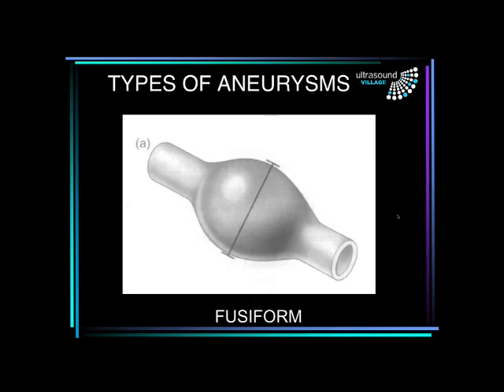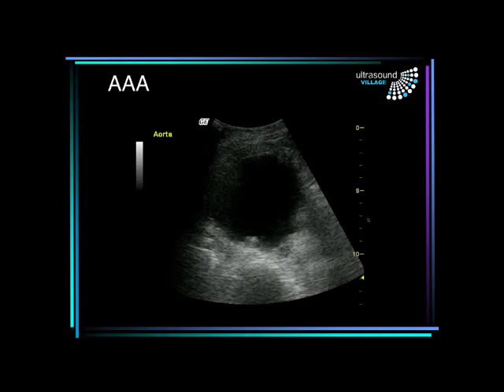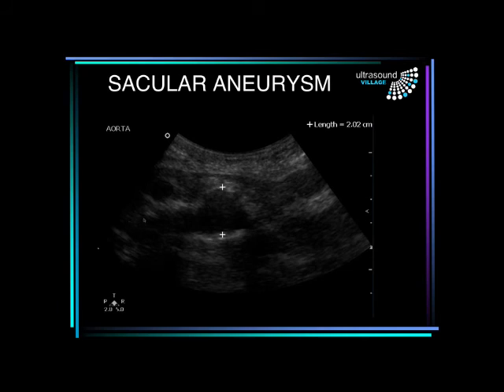In terms of the types of aneurysms, the vast majority are fusiform. Occasionally you can get a saccular aneurysm, but they're very rare. This is a fusiform aneurysm of about 8cm, which we can see quite easily — here is the spine, here is the aneurysm, with some thrombus, so we would measure from wall to wall. This is a smaller longitudinal aneurysm of 4cm in the longitudinal view. This is an image of a saccular aneurysm in longitudinal — here we have the aorta coming down and then the aneurysm. From a clinical perspective in the emergency department, it doesn't make much difference whether it's saccular or fusiform.